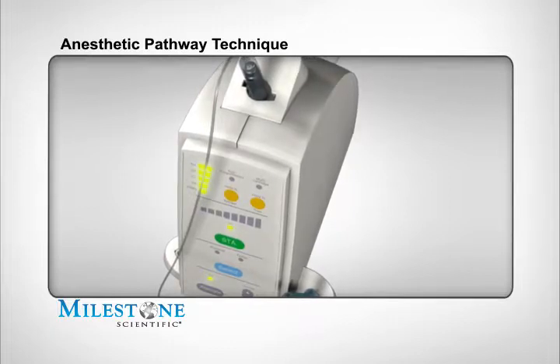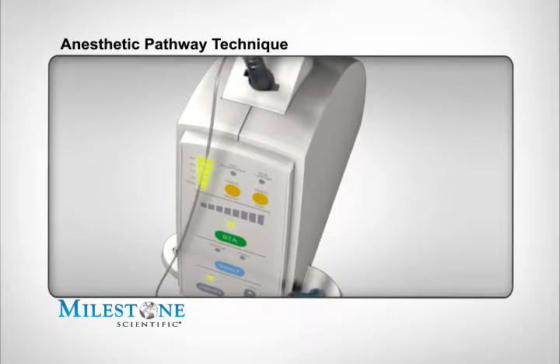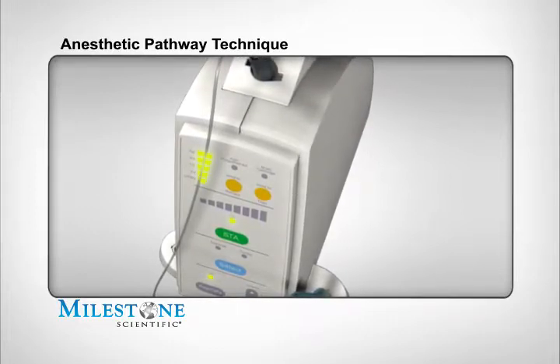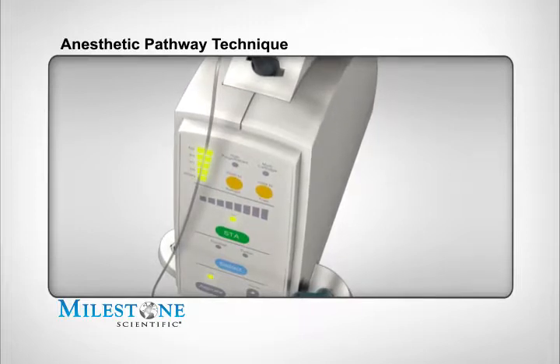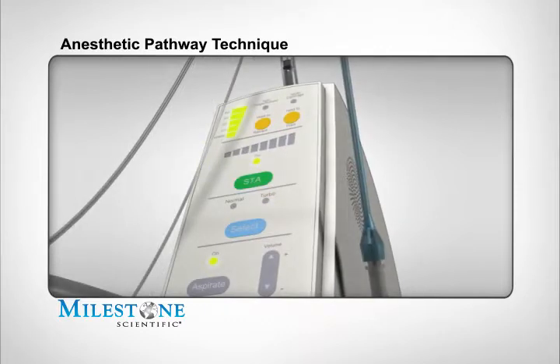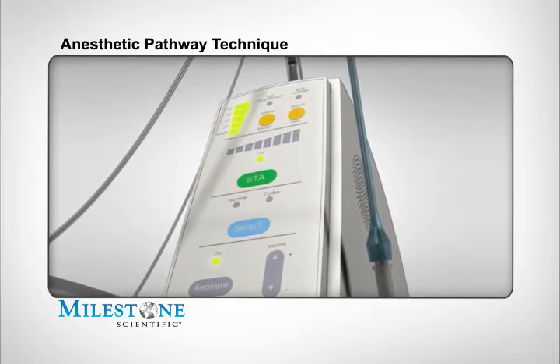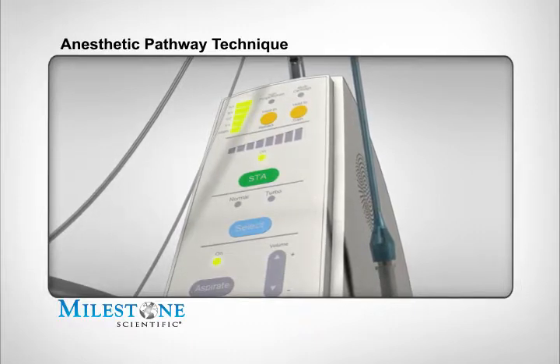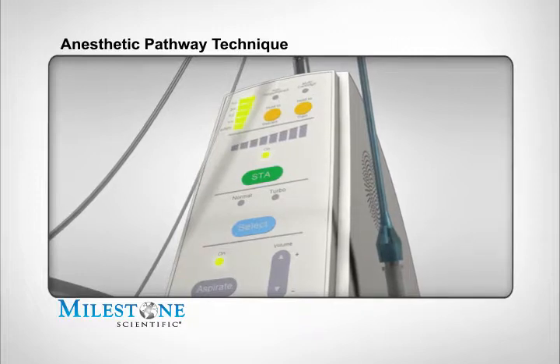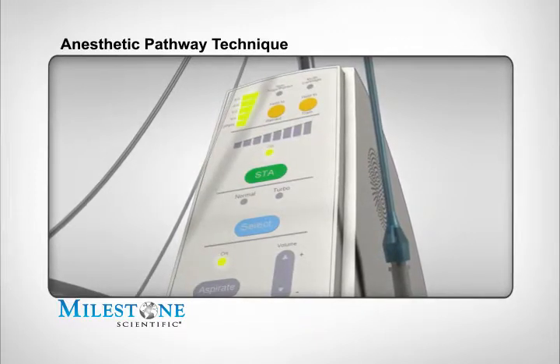The combination of the pre-puncture technique and the precisely controlled flow rate and pressure of the STA system enables both needle penetration and anesthetic delivery to be performed in the safest and least painful manner that patients can experience today. The STA's precision fluid metering combined with a feather lightweight handpiece creates unparalleled control of all aspects of the injection experience. It's not uncommon for patients to be totally unaware if and when an injection has been performed, even in the highly sensitive tissues of the palate.